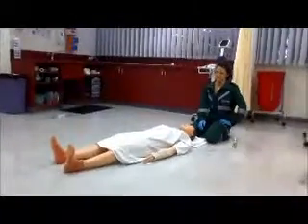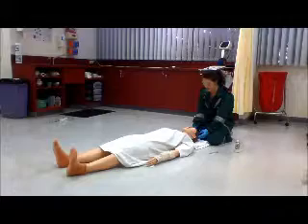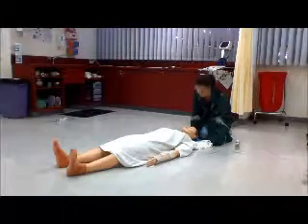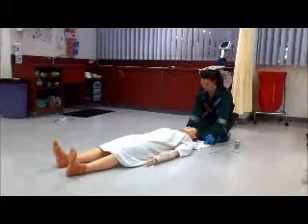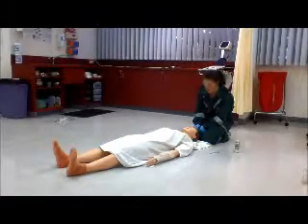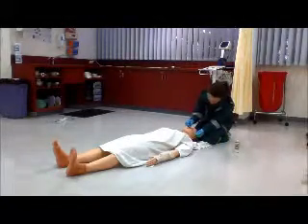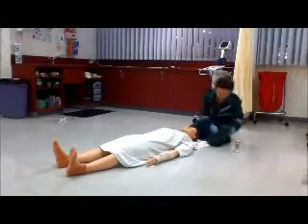I'm now going to demonstrate the insertion of a nasopharyngeal airway. This is indicated when the patient is unconscious and has trismus. The head needs to be supported like before with something soft like a towel or a pillow. Contraindications include middle third facial fractures, significant nasal damage, or traumatic brain injury. First you need to measure the NPA from the nostril to the earlobe to make sure it's the right size, then lube it up.